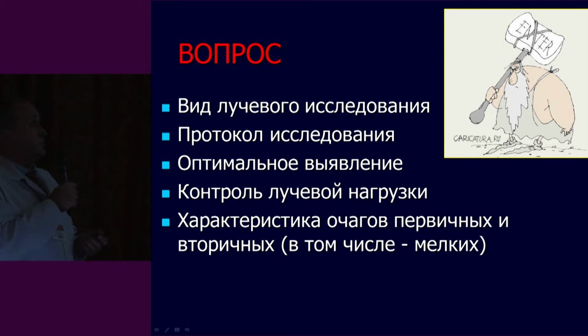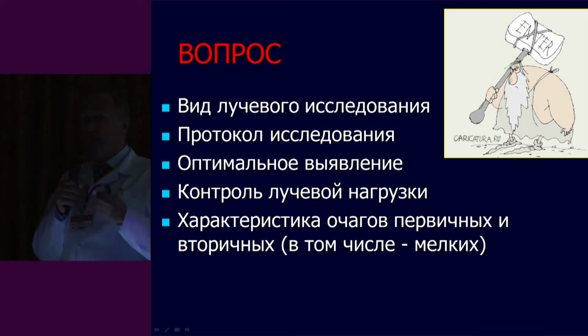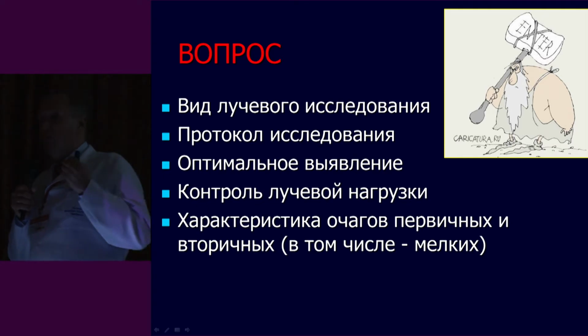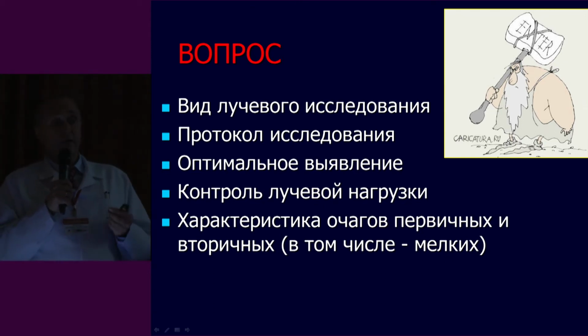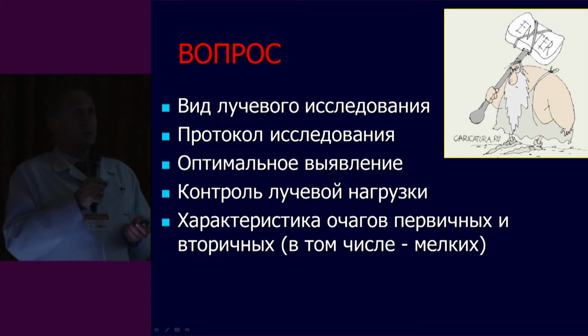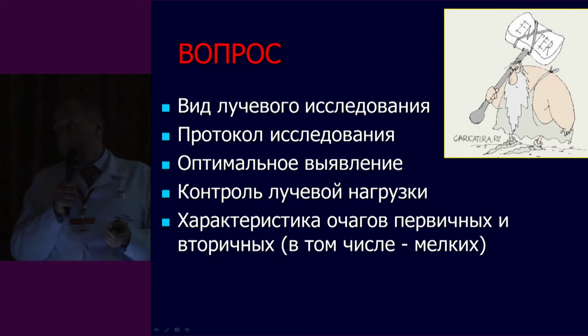And of course we have a question of what kind of radiation modality to use, what kind of protocol to use. And when we have a colic, a biliary colic, a patient is usually referred to the MRI department, and if there are certain disputable situations, then we also perform ultrasound the next day. And the setting having 3 MRI and 2 CTs that run 24 hours is a normal algorithm at the moment. We should understand the optimal detection of the suspected pathology.